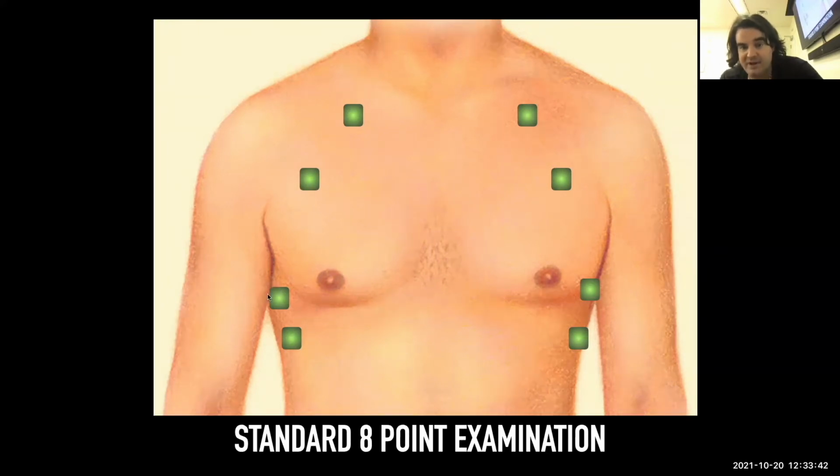And this right here is not assured. You don't technically know where the diaphragm is. I think that's really important to highlight, because making the assumption you know where the diaphragm is leads to abdominal chest tubes. And I've seen that before, because you just can't always guarantee where the diaphragm is or should be.